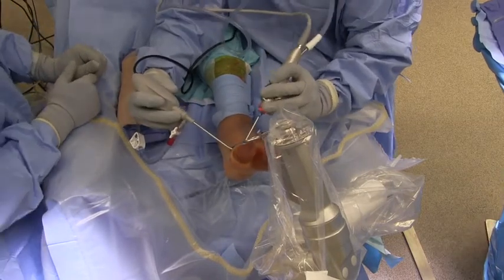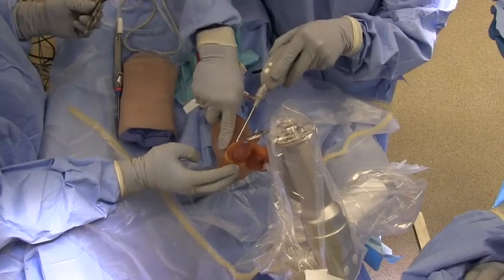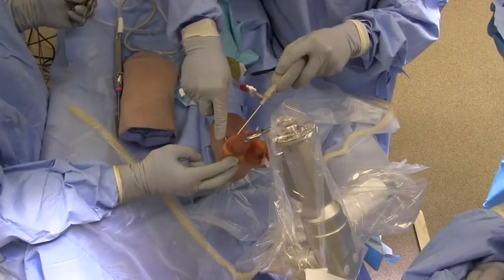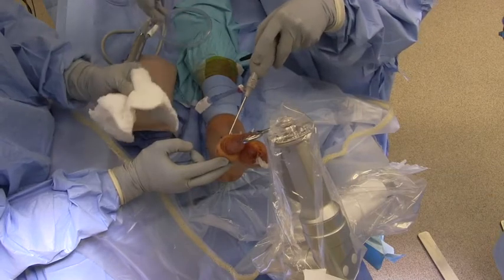We then utilize a small osteotome to mobilize the nonunion site. Intraoperative photos illustrate the technique above. We then remove the nonunion fragment in a simple piecemeal fashion. Intraoperative photos illustrate this technique.